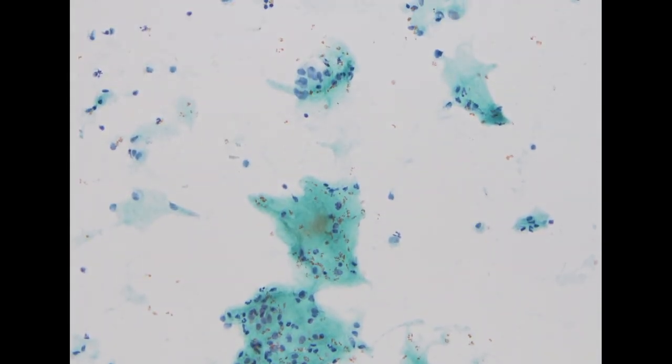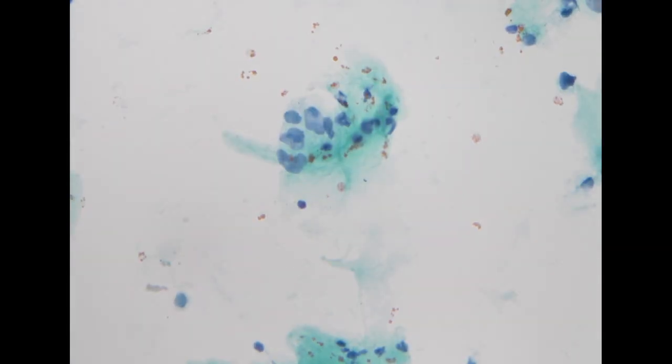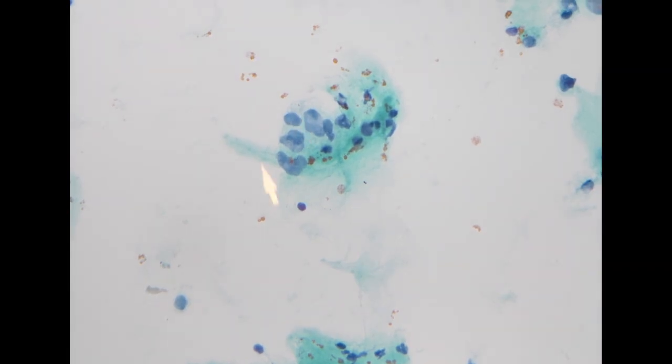In this type of specimen, sometimes the cells will show more prominent artifact, and it is not easy to identify lesions in such a condition. But here we see a cluster of cells with a pleomorphic nucleus and very strange shape, and it seems to form a tight cluster.